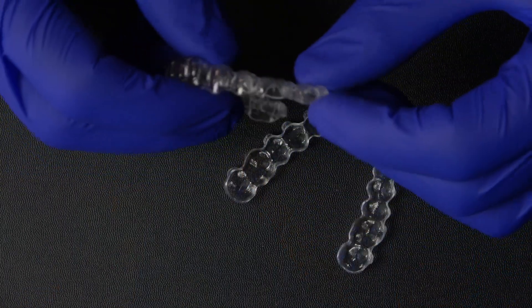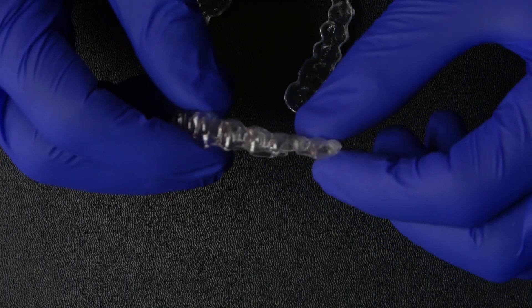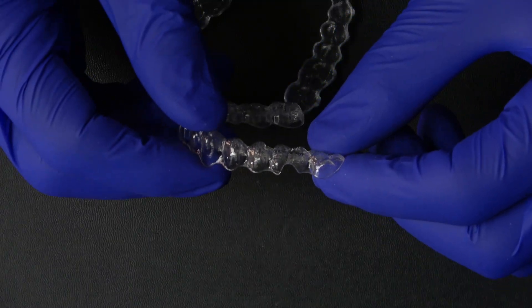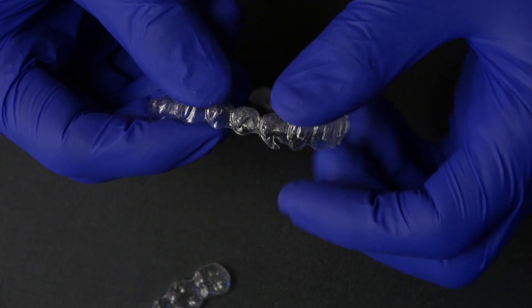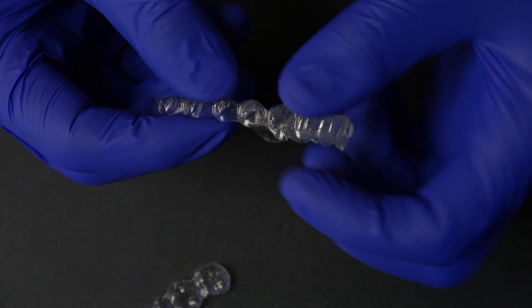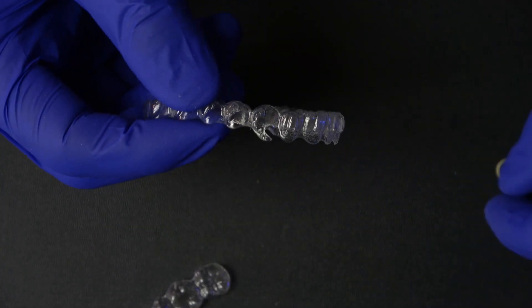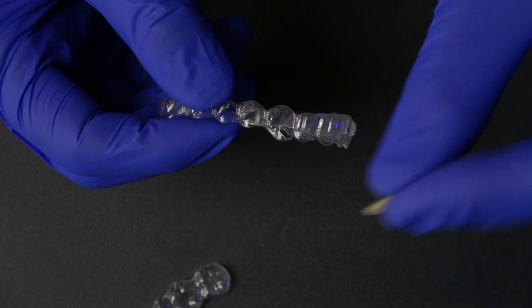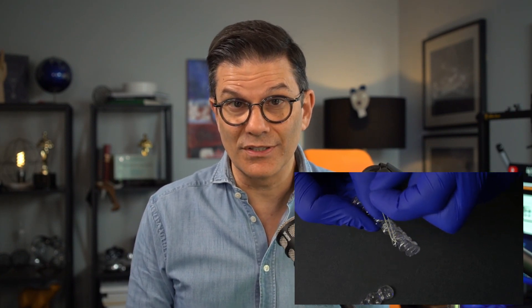Working with elastics can really help in these cases and it's really easy to hook for the patient. There are basically two ways to use elastics: we will either have some cutbacks or cutouts on the aligner, or we will have some hooks on the aligner. It comes already built into your aligner if you put it in your prescription.